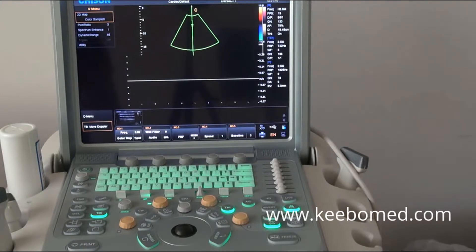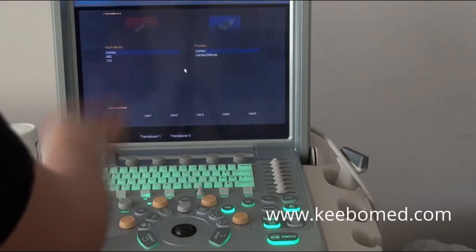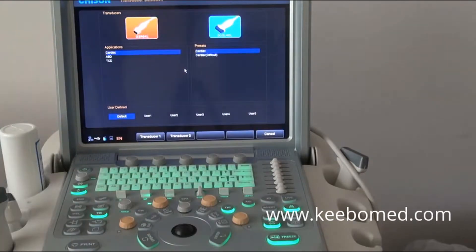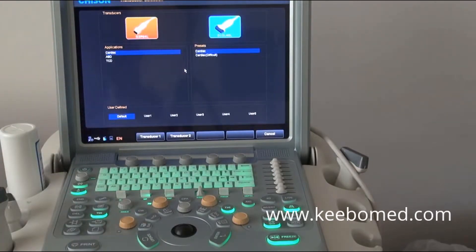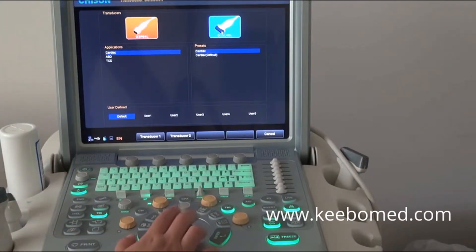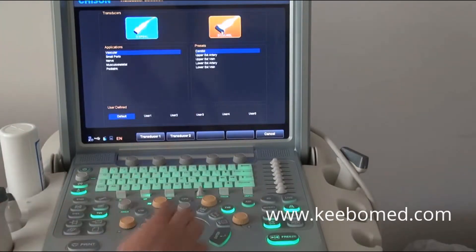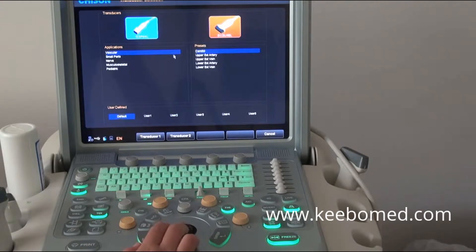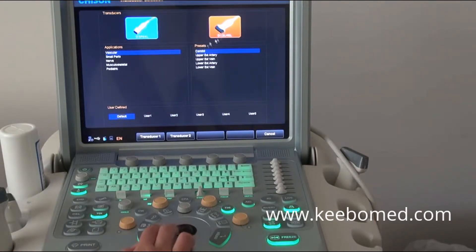That covers the professional cardiac functions. Next, I will show you the general operation for Q9. I will take the high frequency linear probe as an example — the high frequency linear probe with a central frequency of 12 MHz.